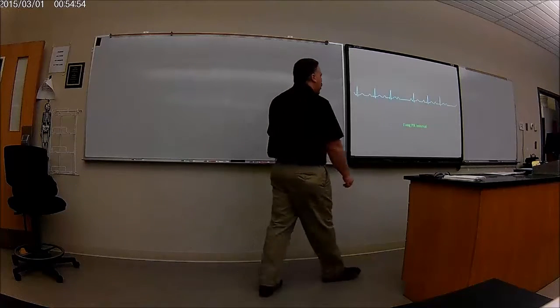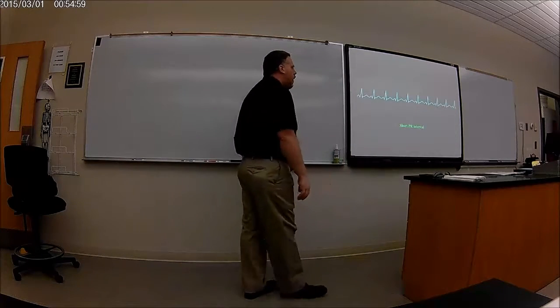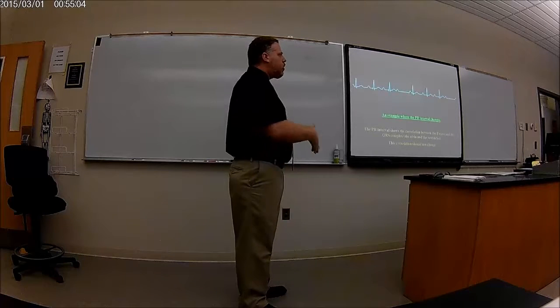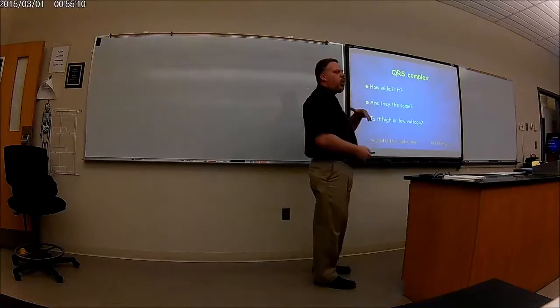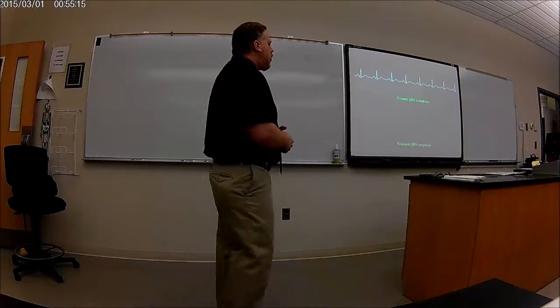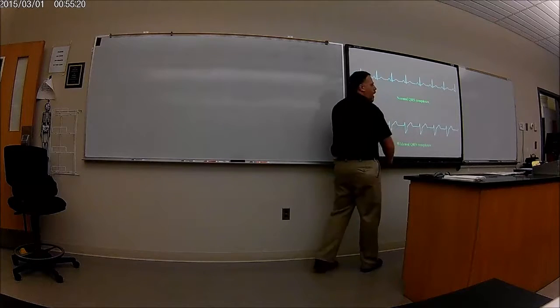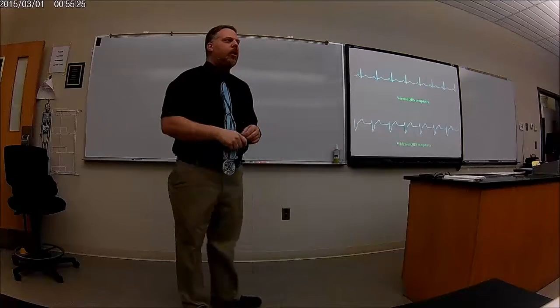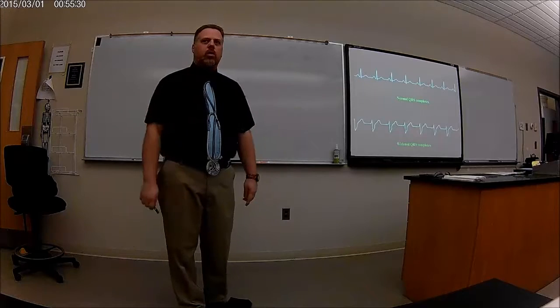So this is showing you long PRs. I showed you long, and then really long. Okay? And these are short PR intervals. All right? So these are just more EKGs you can do. QRS, is it really wide? Are they the same? Is it high, low? These are questions they would ask themselves. Okay? So you can see here, wide in QRS. QRS here is very narrow. Over here, QRS is very wide. It looks weird, I understand, but we also see that it's very wide. It lasts for a long time.